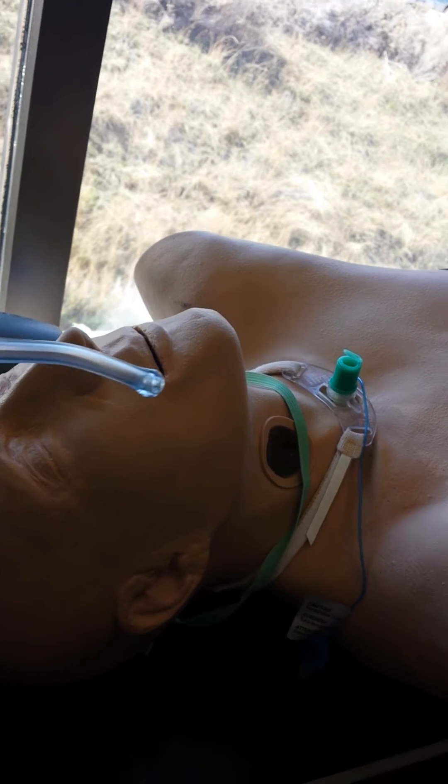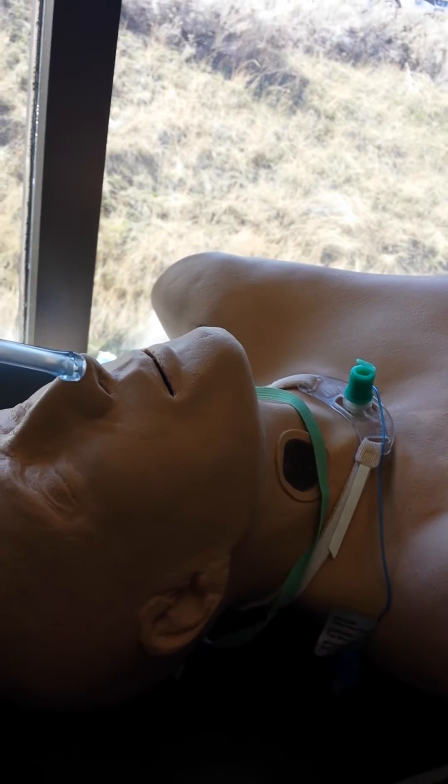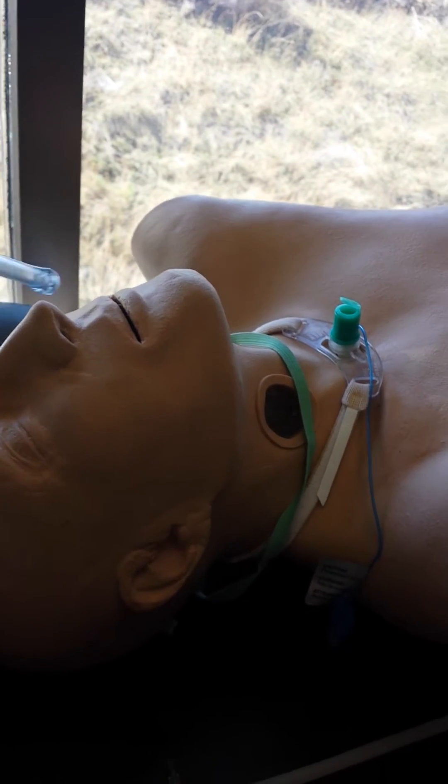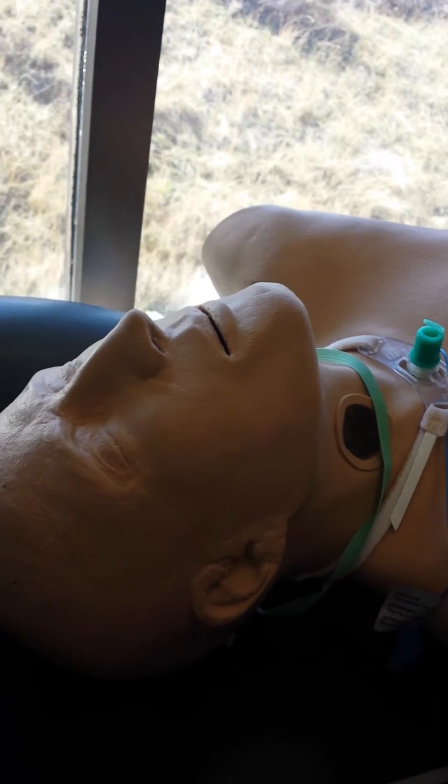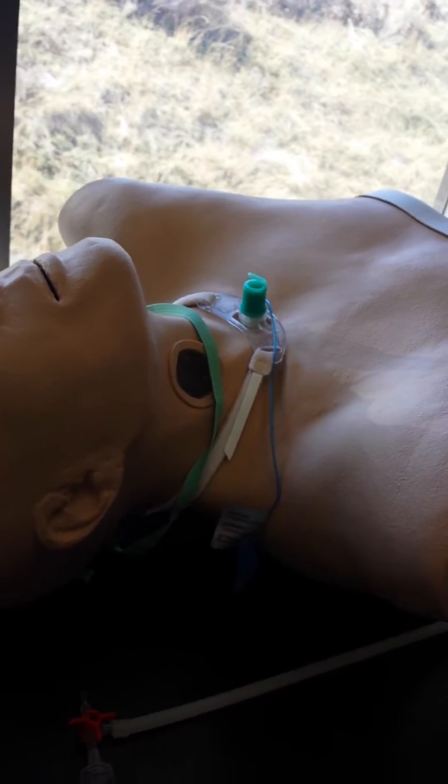Don't actually do it. You tell them you're going to give them deep suctioning to get the secretions above your cuff. And then you're going to talk about suctioning the mouth and the back of the mouth and the tongue area. You're going to just talk about that. Don't do it before you start your procedure.